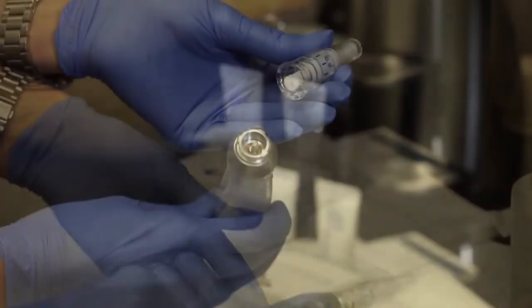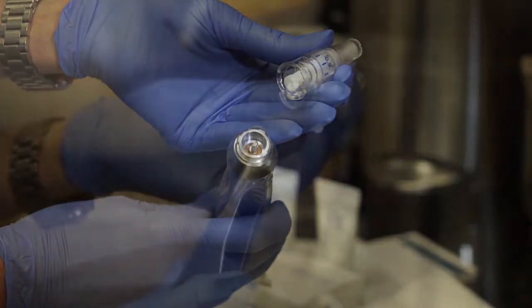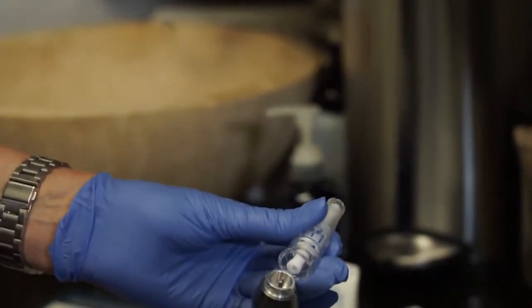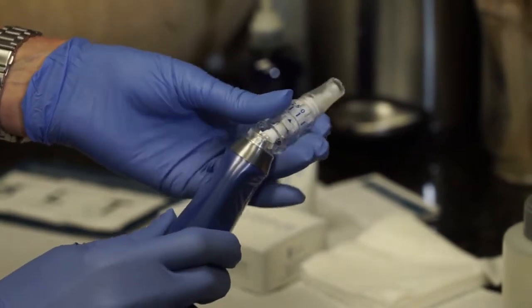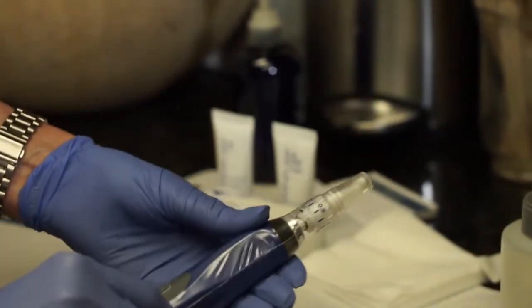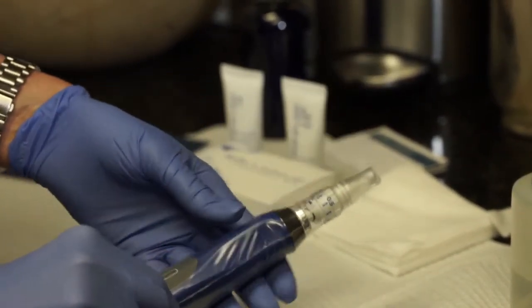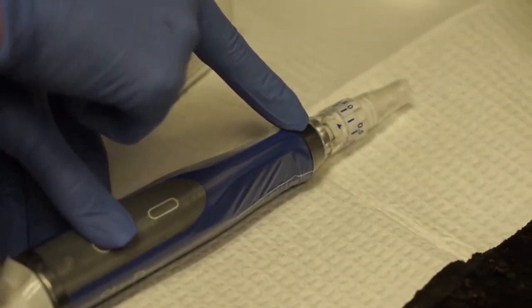Now, there is a male and female half-moon shape within each device that must be aligned for application. Holding the base of the cartridge, identify those shapes and match them up. You may have to turn the metal half-moon in the device to gain alignment. Once aligned, set the cartridge on the device, still holding the cartridge by the base, and slowly turn the cartridge counterclockwise until it clicks into place, indicating it's locked. You should now see the center seam aligned with the depth arrow at 0.